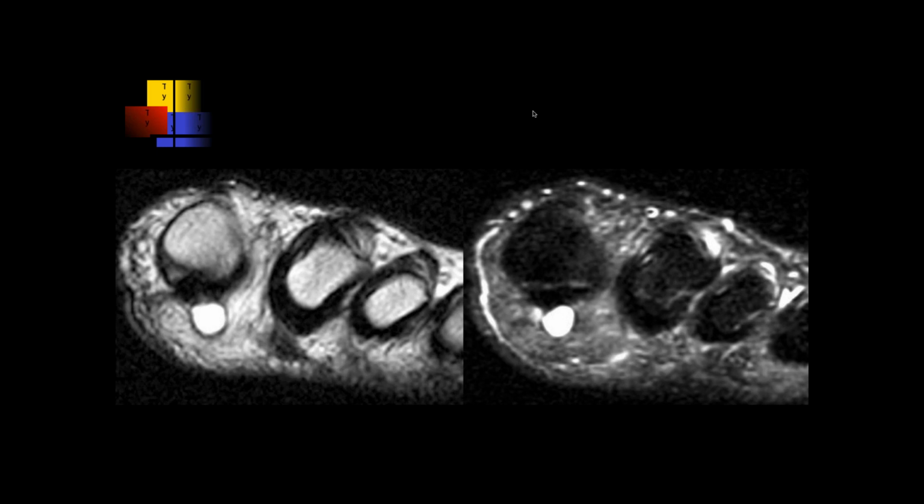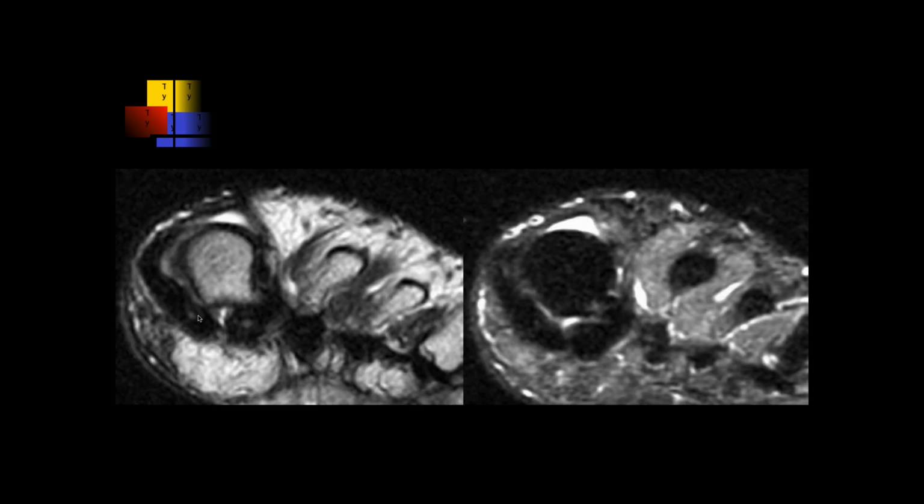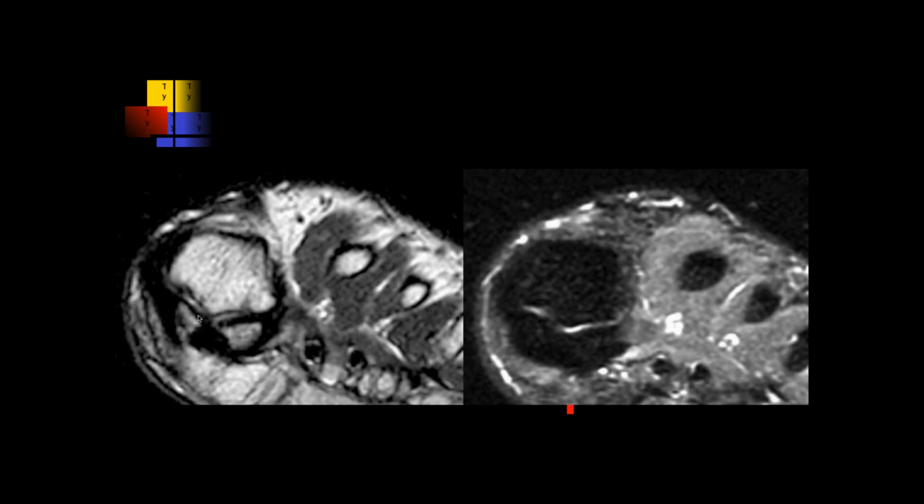Okay, so it looks cystic on these images, some cystic structure just immediately inferior to the first MTP joint. The volar plate, from what I can see, actually I'm not really sure what level we're at. So now we can see that there's some fluid going kind of towards intra-articularly. So I think that's at the level of the intersesamoid ligament. So there's at least some perforation of the volar plate, creating a cyst underneath.